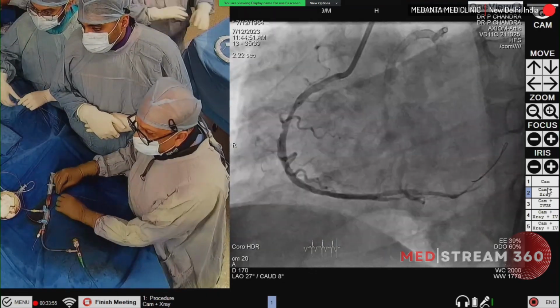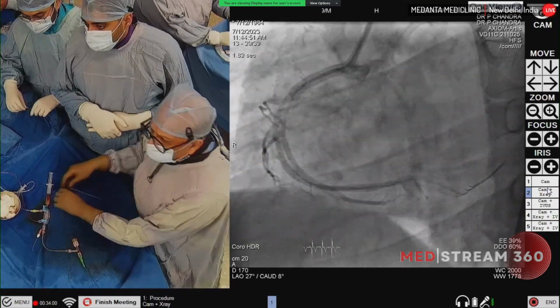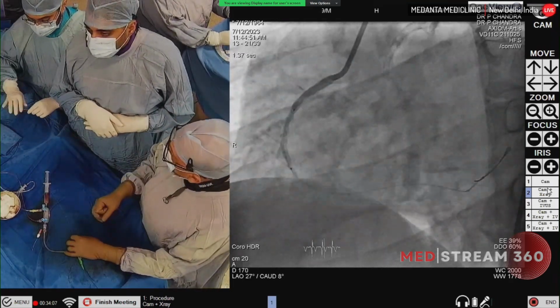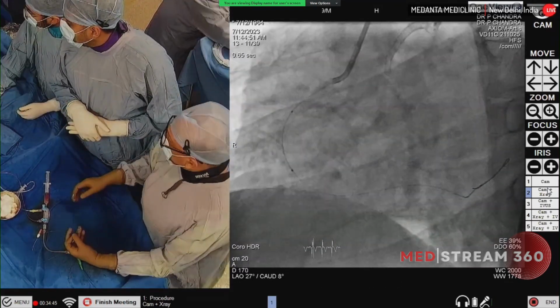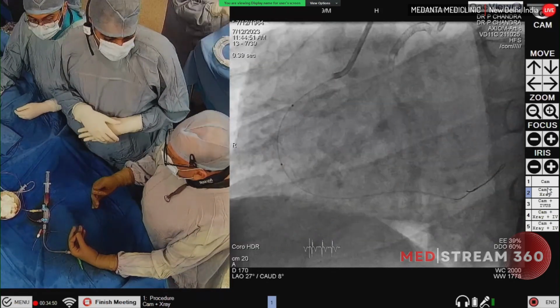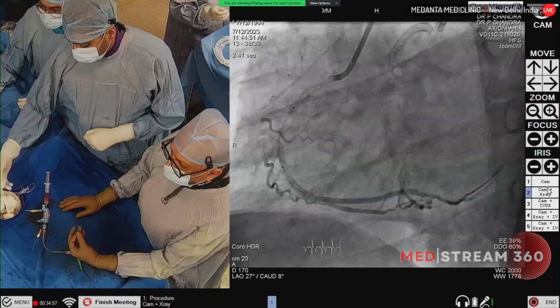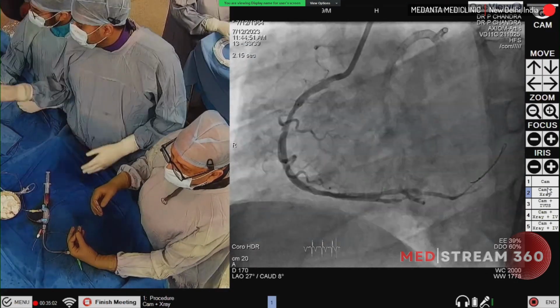To measure the size of the stent we have to take, you can see that we can easily take maybe a 30. It's better to take a little longer one. Yeah, 30 to 34. 38. Give me a 38, please. So there are plaques all over, but certainly we'll match the luminal diameter and the distal segment, and then proximally we can go ahead a little higher with a 3.5 if required.